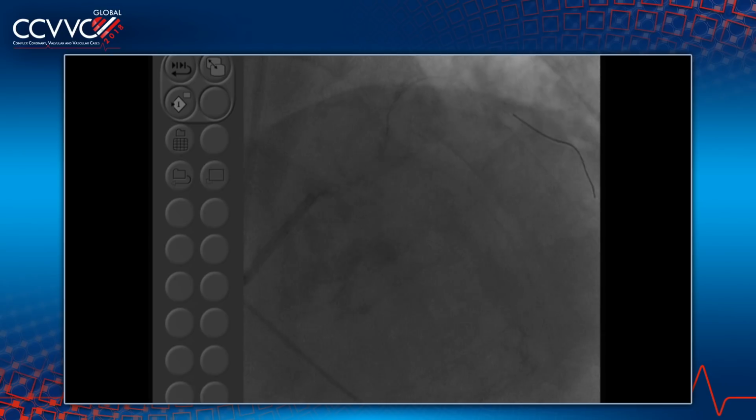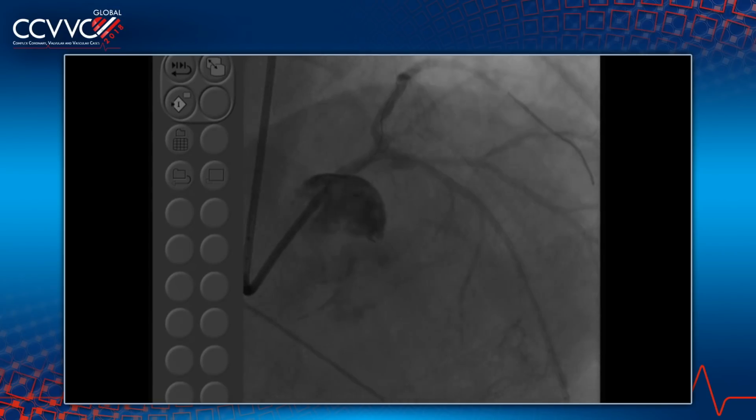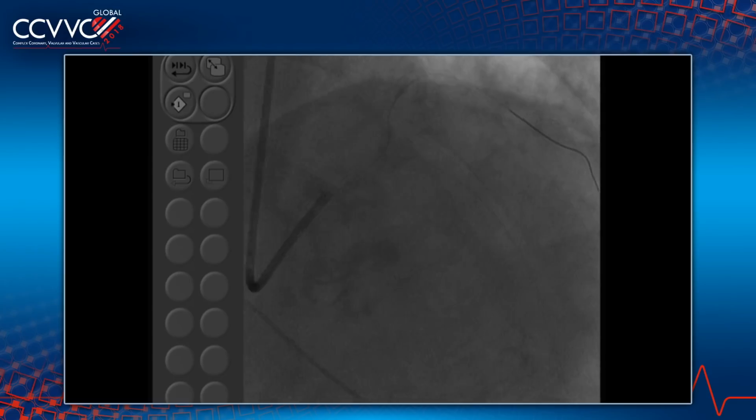How is the patient's blood pressure? And what did you think about using Impella, as John said just after balloon valvuloplasty? This is a few cases we have done, where there is tight disease of the left main, bad LV, this patient has a hyperdynamic.